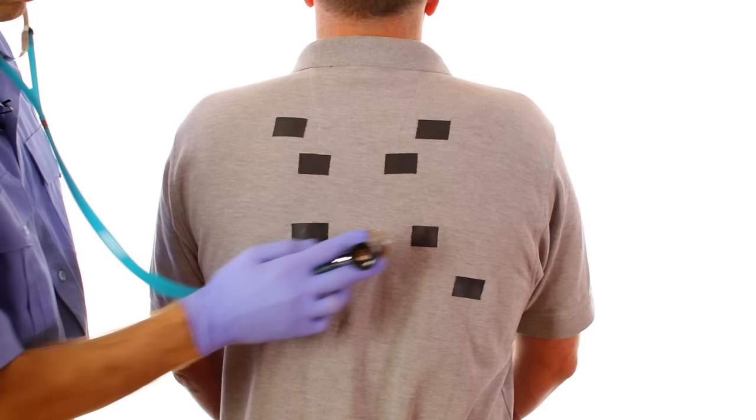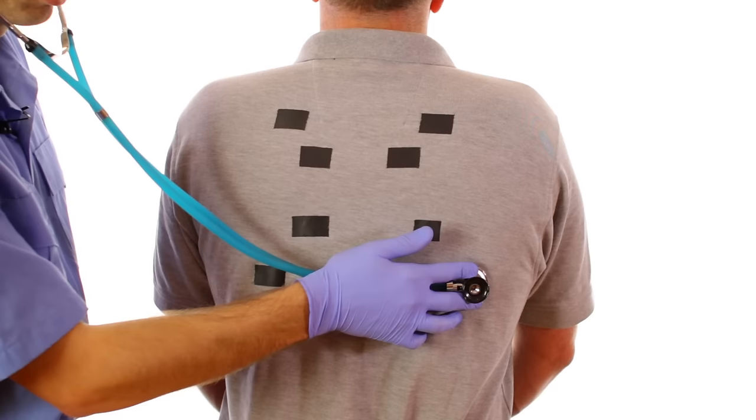Work your way down the lower lobes of each lung, remembering to auscultate both the left and the right lung before moving to the next auscultation point.